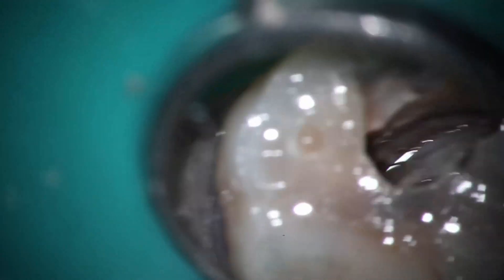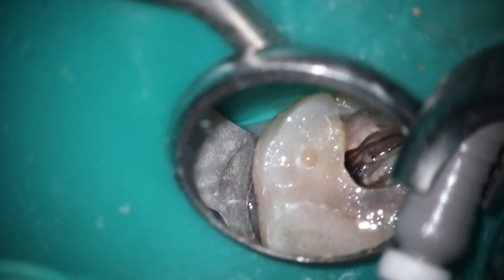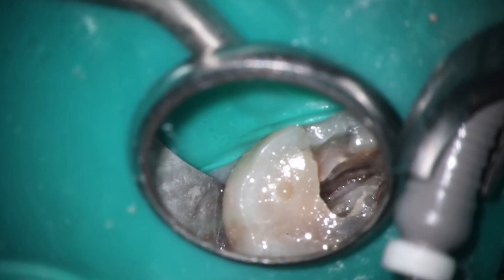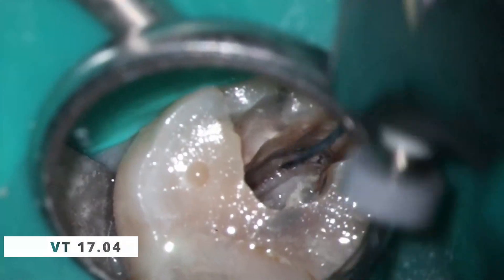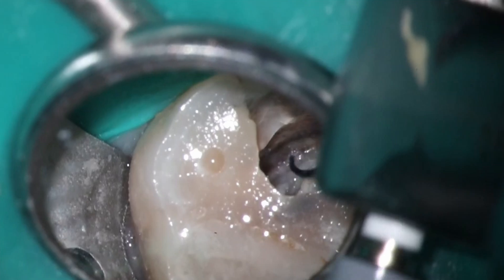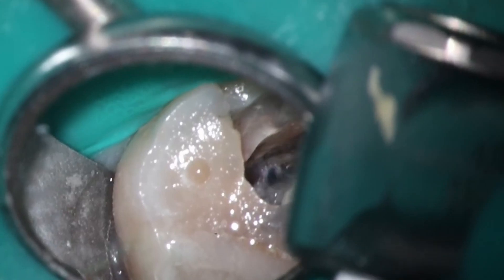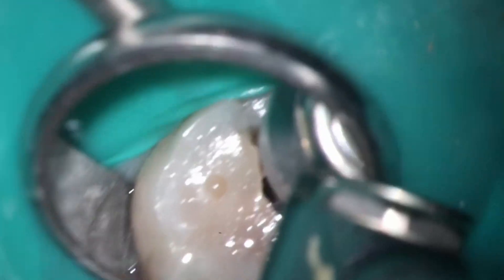Now that we're inside, you can see that staining — it's definitely dark from all the decay. The 20/06 is able to pick up a little bit, but I also found this little spot right here that almost has a line running the entire length. This isn't a fused root, but it almost behaves like one. In cases like this, I like to take the 17 and peck along as it's running — you can see stuff along that entire length. Rotaries pull up debris, and you can see it drop down very readily with no issues. Same length as that MB1 — there's your MB2.